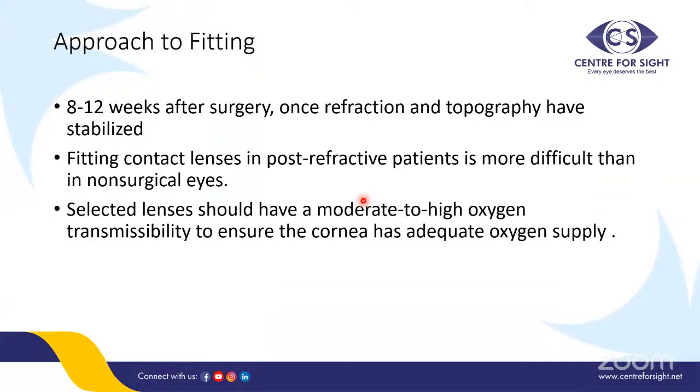So how do we approach fitting of a contact lens? Number one, post-refractive surgery, give time to the cornea to heal. That is, we ideally go for 8 to 12 weeks of stabilization, and only once the refraction and topography have stabilized do we plan a contact lens fitting, in case the patient is eligible for it.